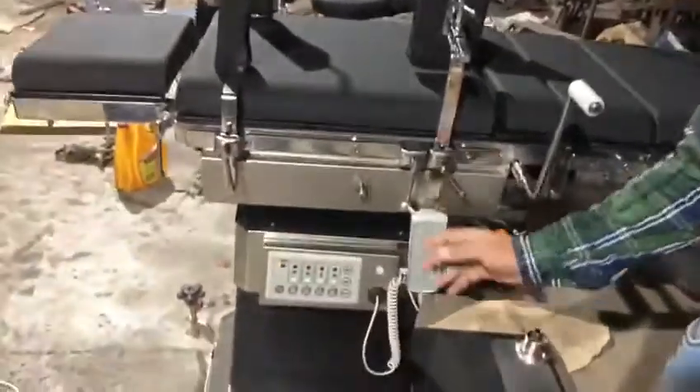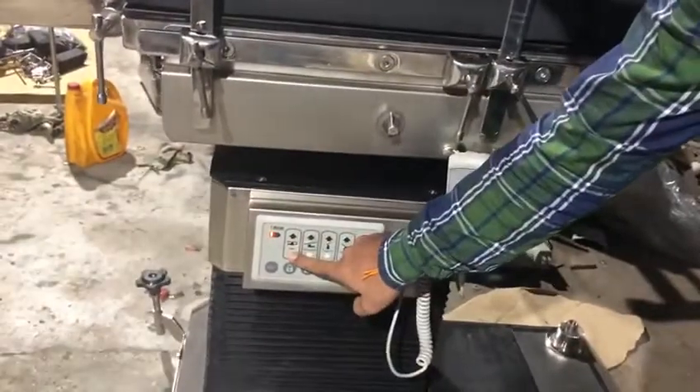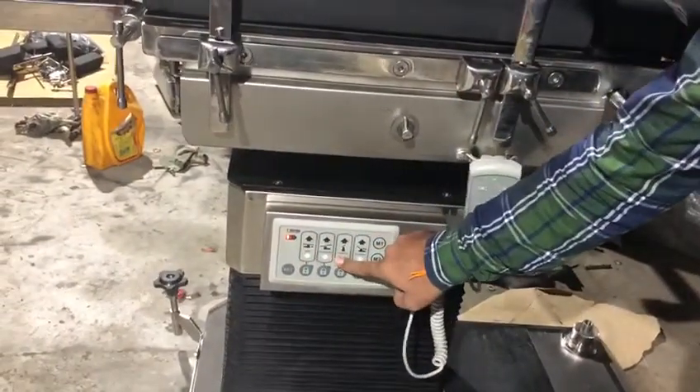Likewise we have a panel. If the surgeon wants to move it from a panel, an electronic panel, he or she can do that easily.